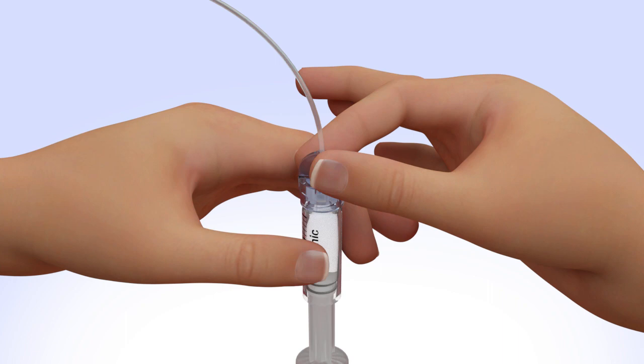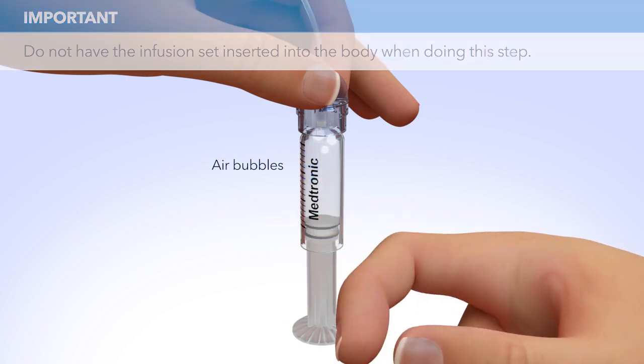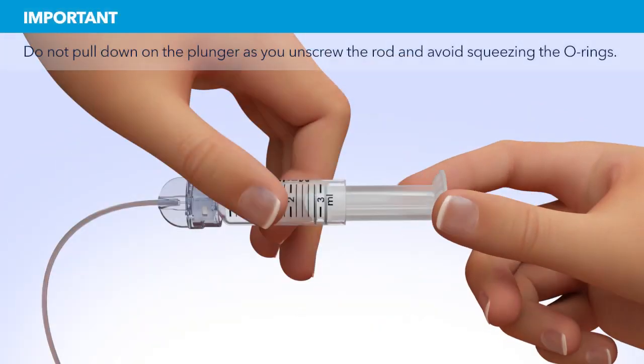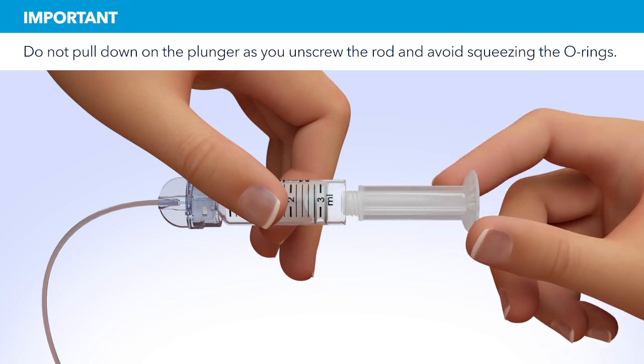The tubing connector should not be loose or come apart from the reservoir. Tap the reservoir to make any air bubbles rise to the top. Purge the air bubbles that have risen to the top by slowly pushing up on the plunger until all of the air bubbles have been pushed out of the reservoir and you see a small amount of insulin in the tubing. If you're not able to push insulin into the tubing, disconnect the tubing connector and then reconnect it. Unscrew the plunger rod counterclockwise until it completely separates from the reservoir.